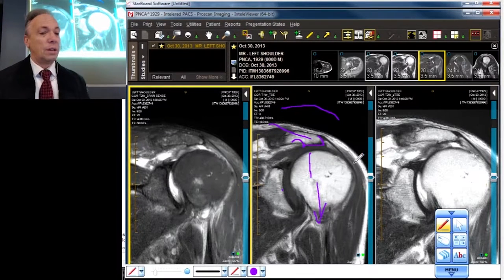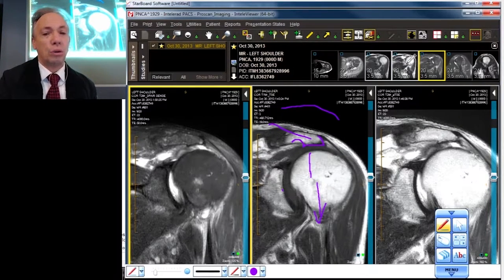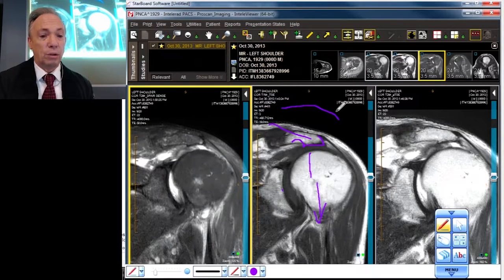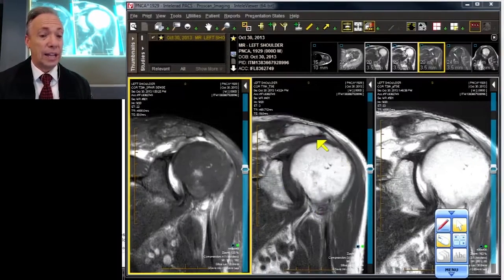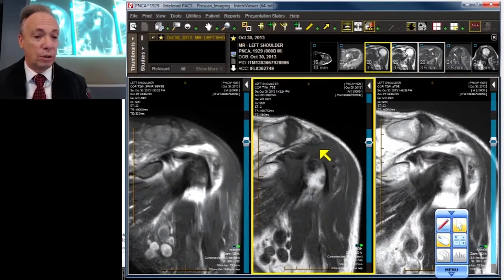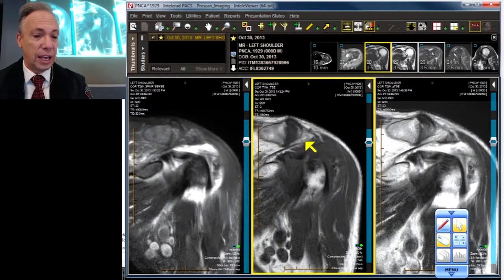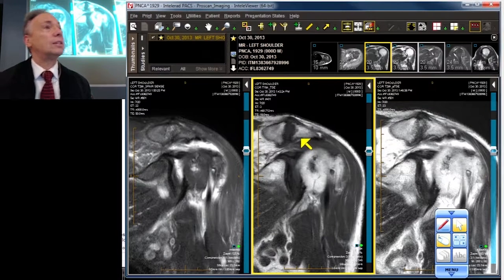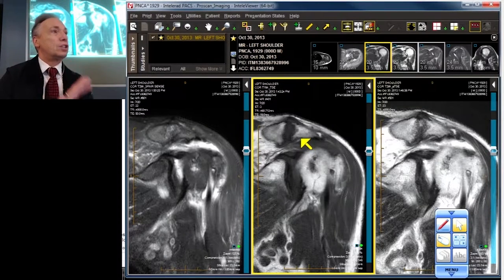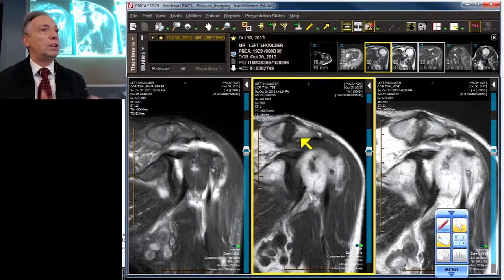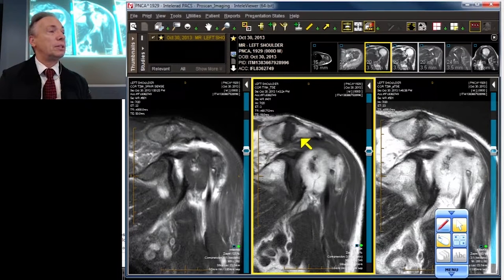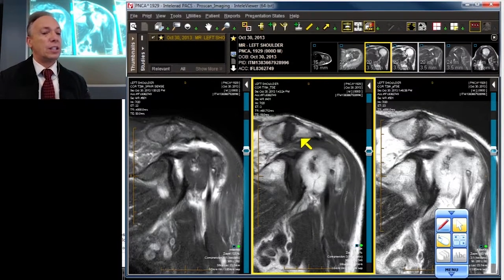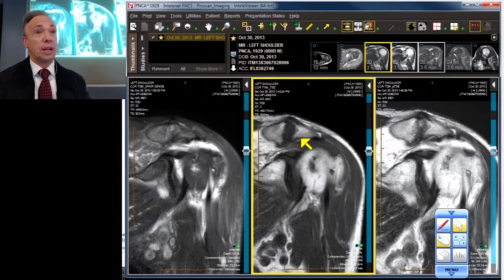Another structure that participates in this process is the coracoacromial ligament, which comes off the acromion and heads toward the coracoid. In this patient the coracoacromial ligament is not very thick. Most of the time, if you had to decide whether the ligament or the bone is the bigger contributor to anatomic encroachment, it's more often the ligament than the bone — roughly 60/40 or 70/30 — but either one can do it, and sometimes it is both.